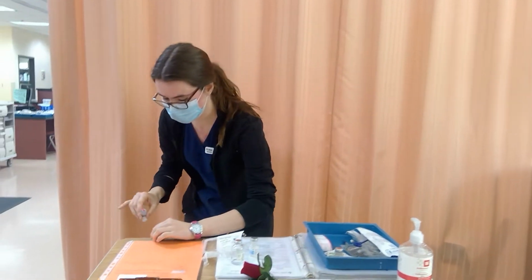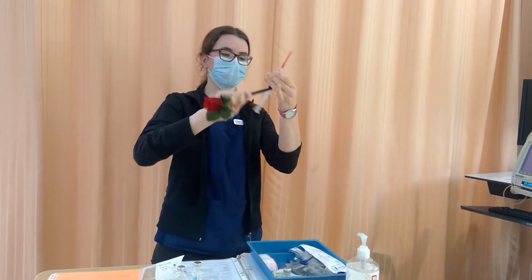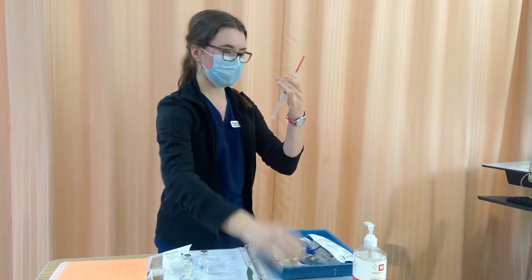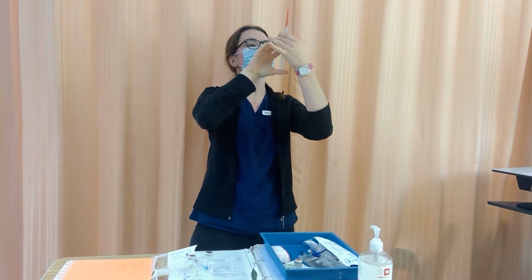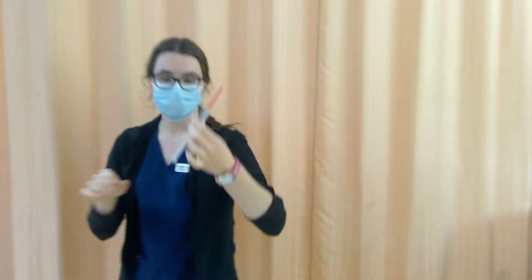Now I'm going to recap utilizing the scoop method, just to prevent any sharp injuries and also keep the hub free and making sure it's not touching the table. Tap out my bubbles. Now I'm going to recalibrate to exactly 8.2 milliliters. So I see I have 8.2 milliliters of sterile water without any bubbles.